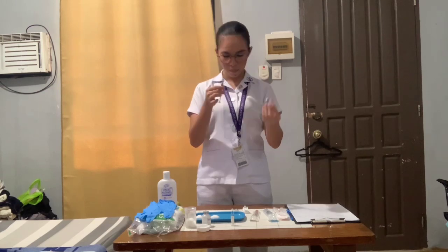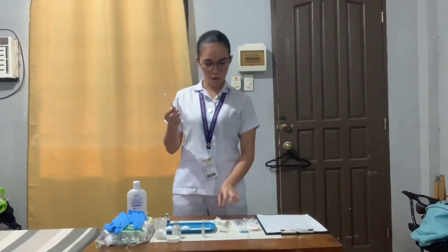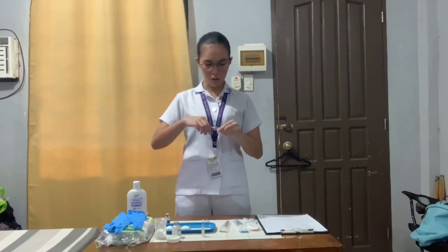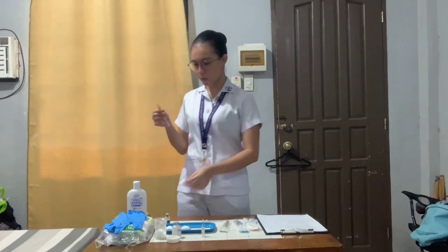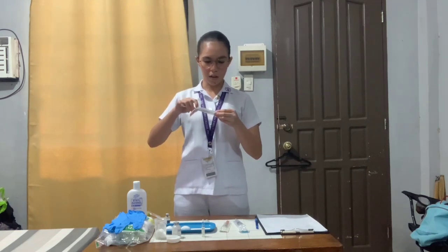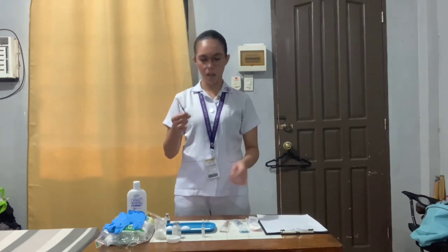So now it's done. Now make sure that there is no air in the syringe. Okay, so we are just going to withdraw the air. Then after that, we are going to cap the syringe. So now that the medication is ready, we are going to dispose of the filter needle back into its packaging, and then we are going to discard this into the sharps. So we are going to put back the needle tip of this syringe. So now this medication is ready.